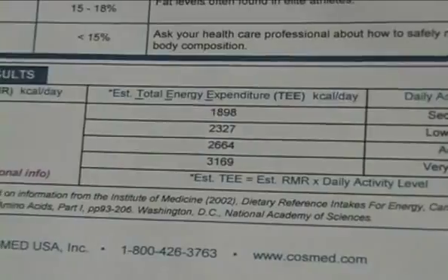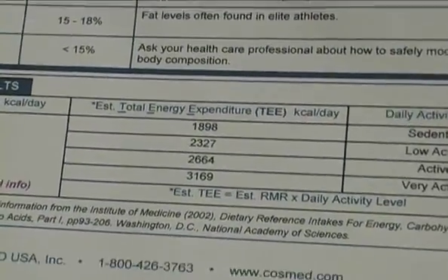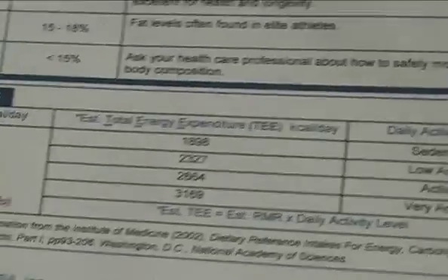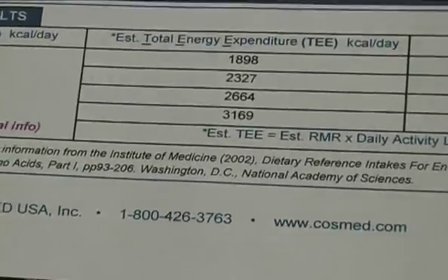And then based on her activity level, whether she's sedentary all the way to very active, is her total energy expenditure. So taking into account any exercise she's doing, work, and so forth, above and beyond just living and breathing. So that's essentially what a printout looks like.